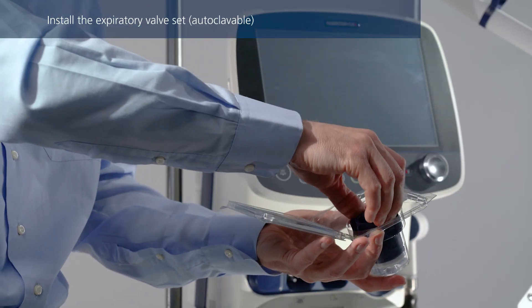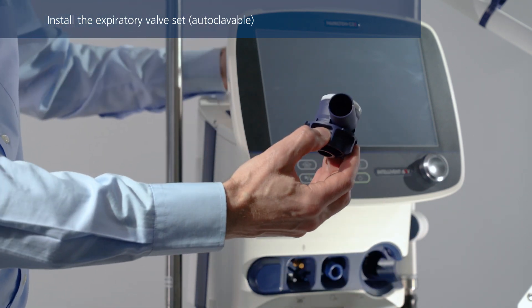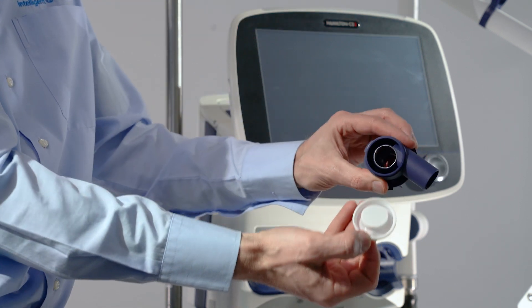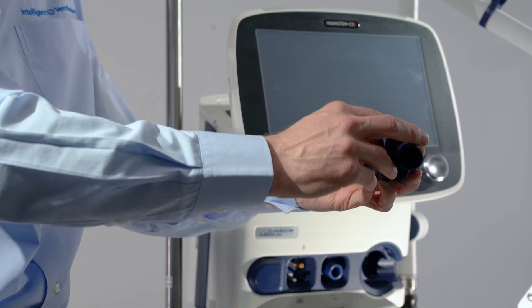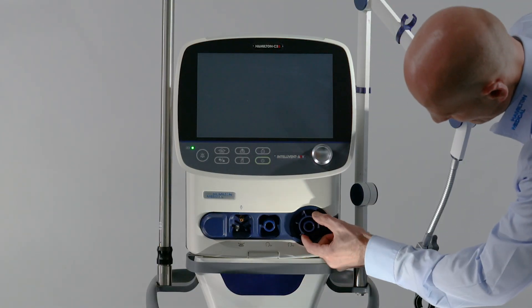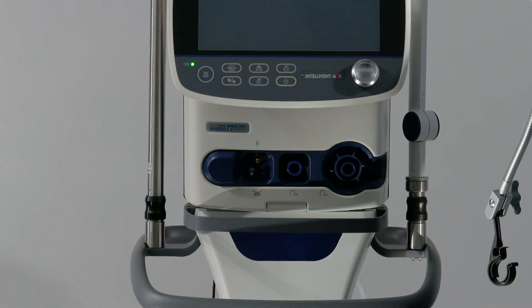If you are using an autoclavable expiratory valve set, first assemble the expiratory valve set by placing the silicone membrane onto the expiratory valve housing. Ensure that the metal plate is facing upwards and is visible. Position the valve in the expiratory port, ensuring it is straight, and twist it clockwise until it locks into place.